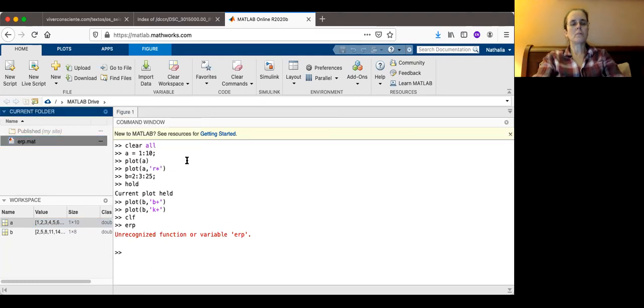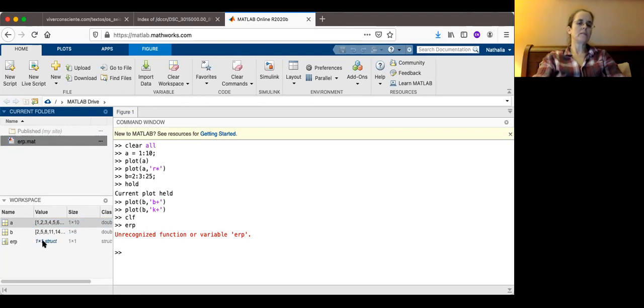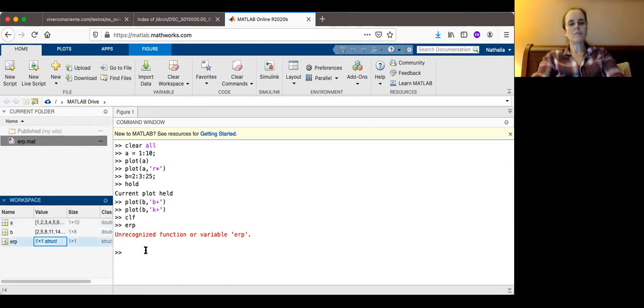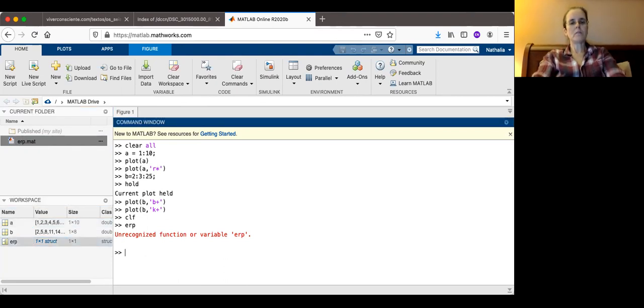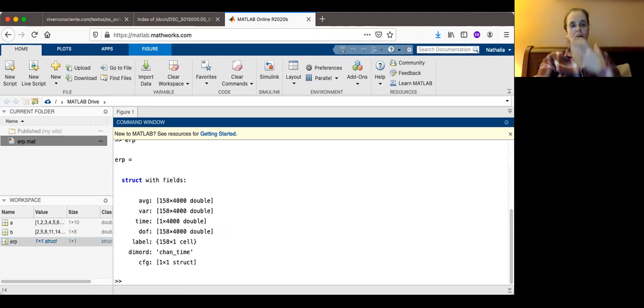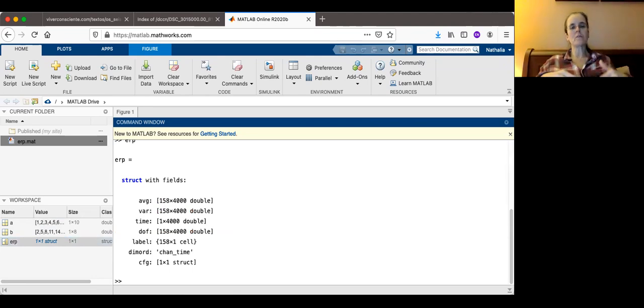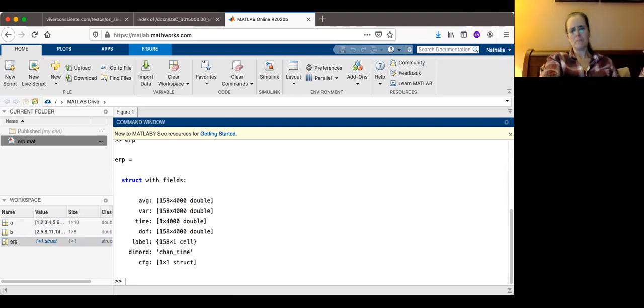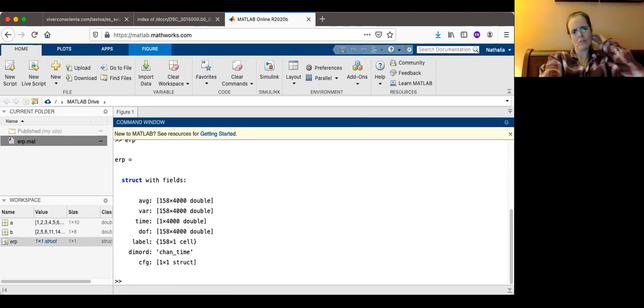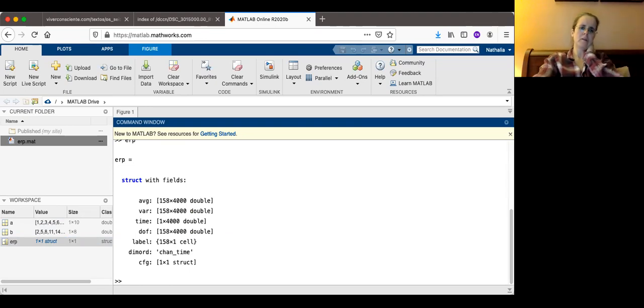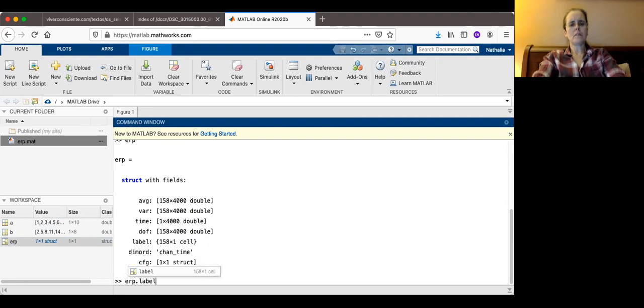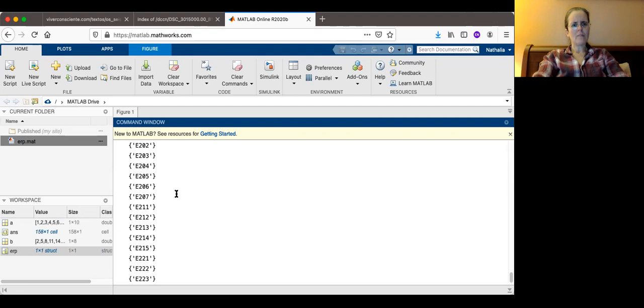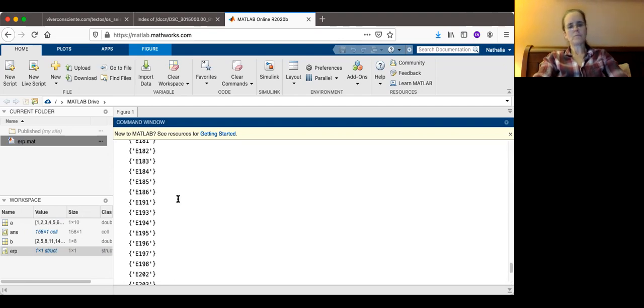I have to open ERP.mat. So now from my drive, it's coming here and ERP is a one by one structure. If I try to take a look at ERP, it shows me it's a structure with these fields. There are several fields, average, I think it's variables, time, DOF, which is not clear to me what it is, a label.